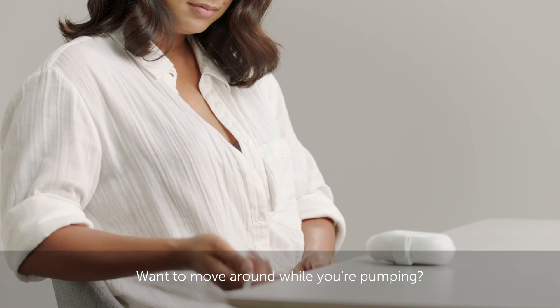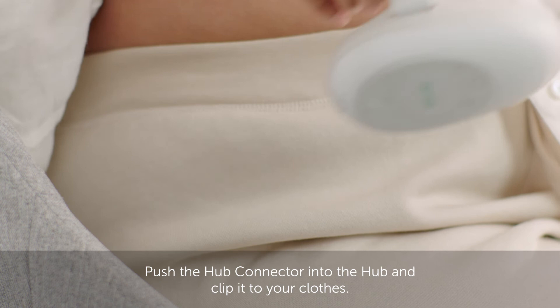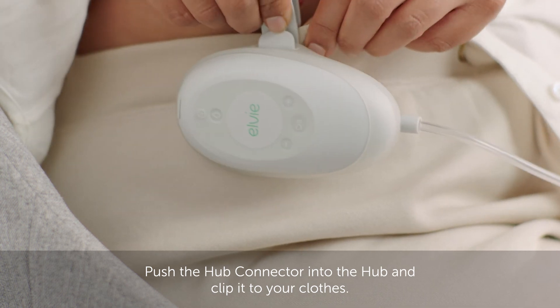Want to move around while you're pumping? No problem! You can attach the hub to your clothes. Push the hub connector into the hub and clip it to your clothes.